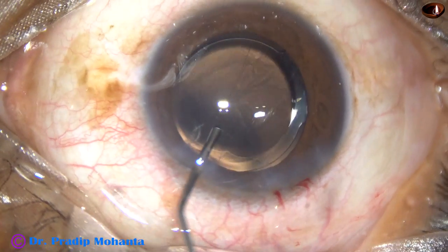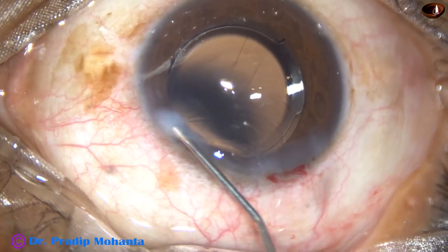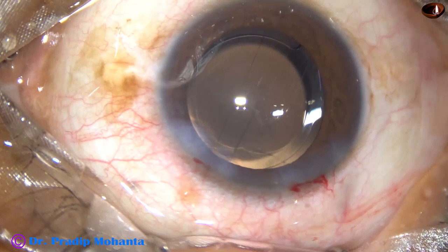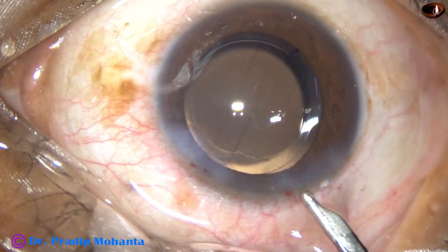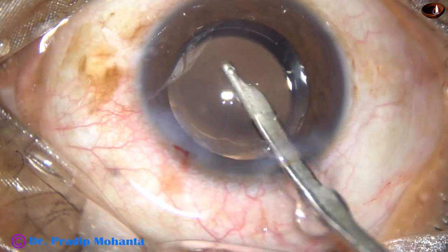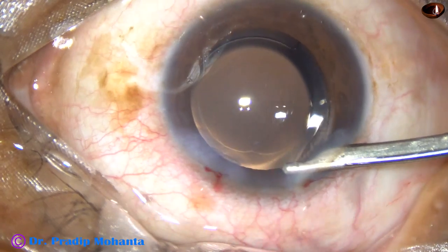This is moxifloxacin. Now I hydrate the side port and close it by corneal stromal hydration. Once this is done, I do a final lavage of the anterior chamber. After this, the anterior chamber is nicely formed.